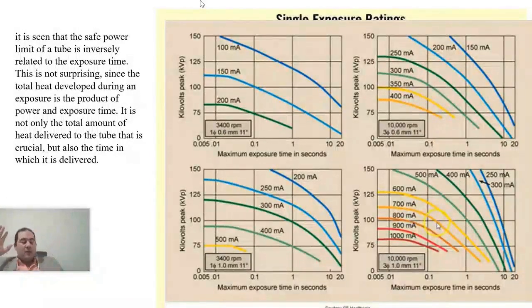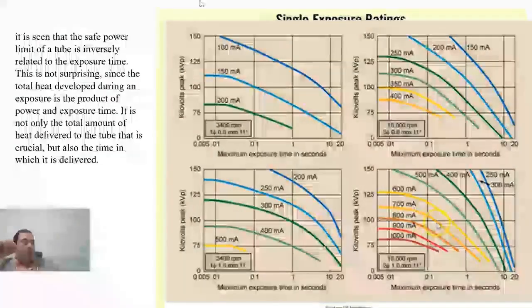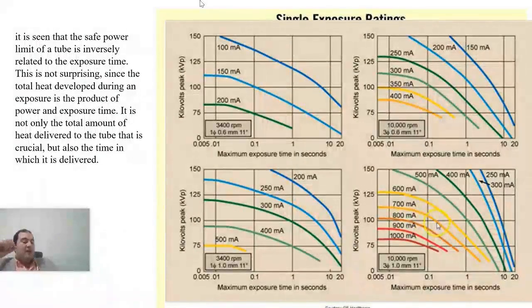For instance, if you are conducting a triphasic scan, the triphasic here involves moving through different phases, such as giving a scan without contrast, followed by an arterial phase, then a portal phase, or a portal venous phase, and then a delayed phase. There are several scans involved, and you send them for further analysis. So, the scan time here, or the exposure time, doesn't allow for cooling down, for example, in 10 seconds, or maybe in 5 seconds.